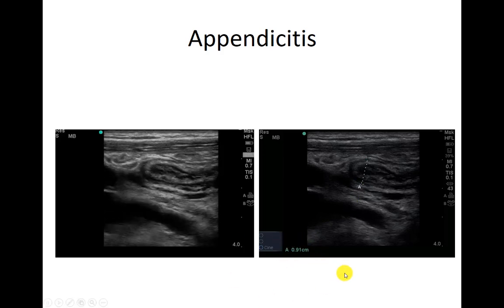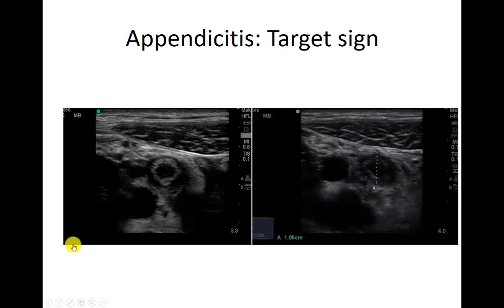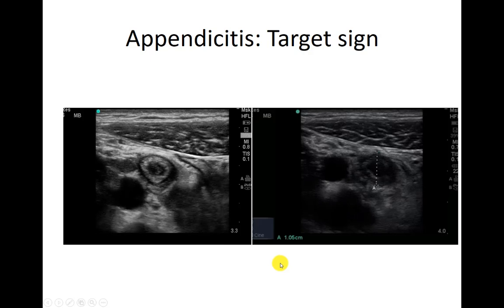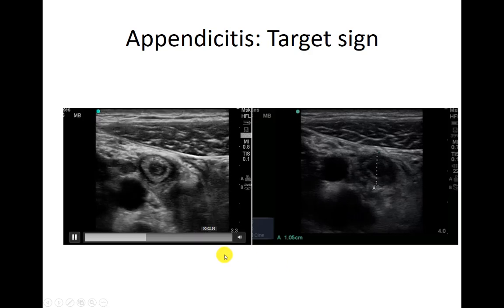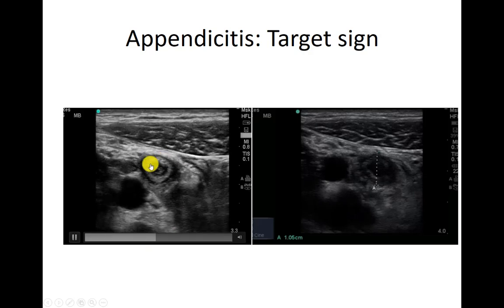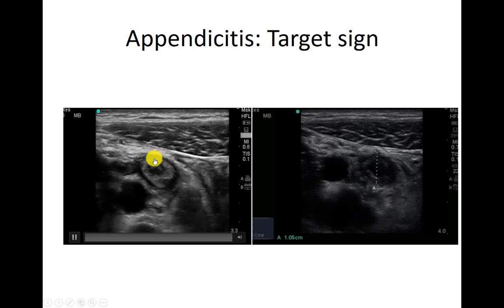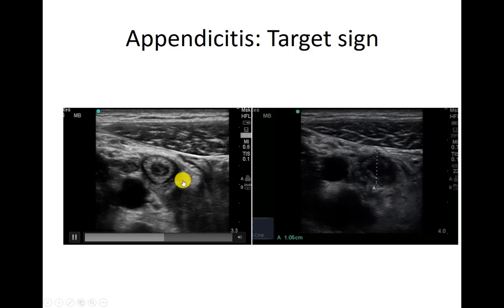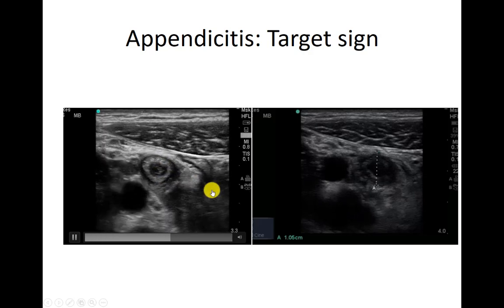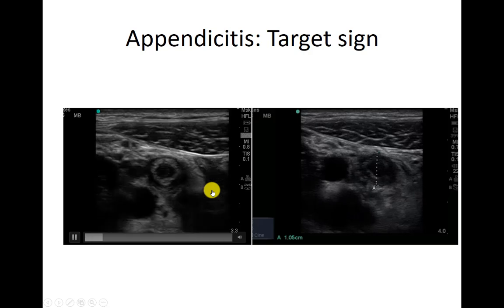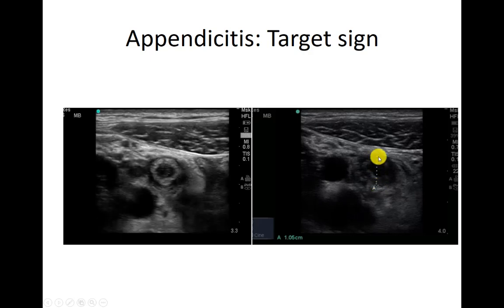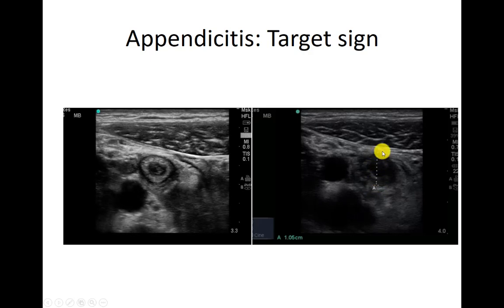Here's another example in the short axis. You can watch as the operator is pressing — the vessel is kind of moving up and down. If you've ever squished on somebody's bowel, it should just squish away. This isn't squishing away at all — this little target sign, this little circle is just staying right there. When we measure again from outside of black to outside of black, we're getting about 10 millimeters. That's too big.